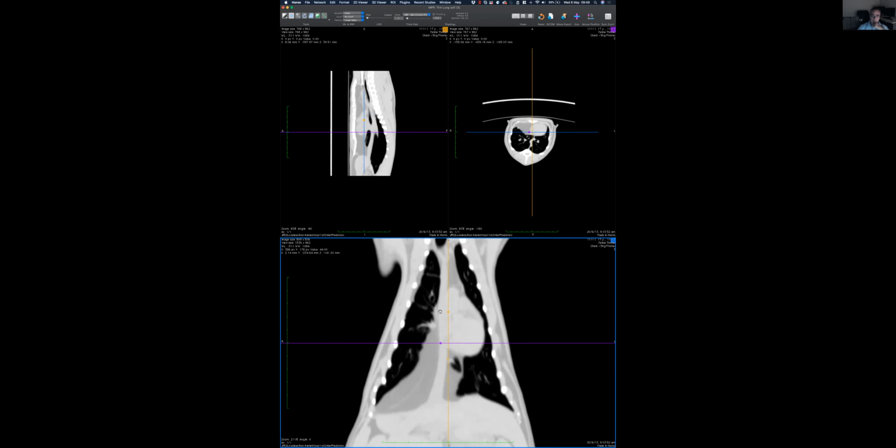In the same way, see the shifting becomes more clear in the CT. There's a shifting of the heart. Actually, that is one of the indirect features of hernias. Makes sense? Sometimes you don't see the rupture, the interruption in the continuity of the diaphragm, which is our primary, direct evidence. The indirect evidence is cranial displacement of abdominal structures or mediastinal shift. Makes sense? Because there's something in that thorax that doesn't belong.